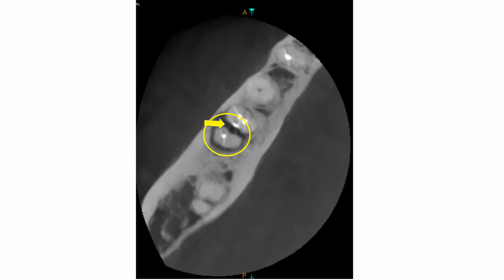And you can see this huge lesion associated with the whole tooth, and you can see that the mesial root has a lateral canal, and with this treatment, I hope that we can get healing.